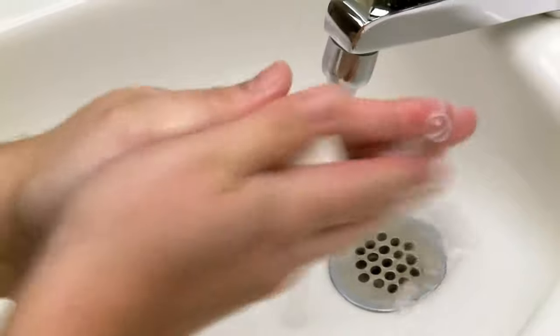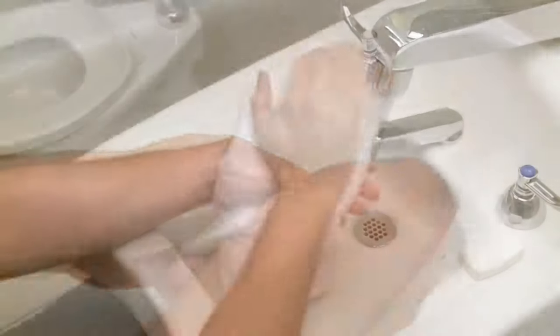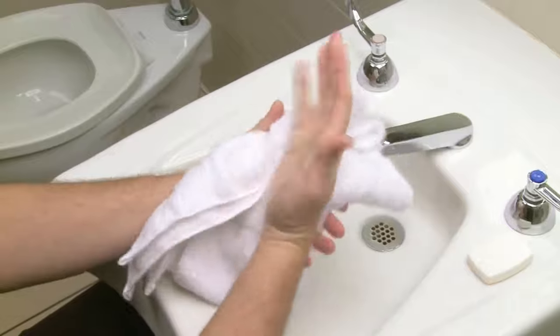Now, wash your hands thoroughly with soap and water. Dry your hands with a clean towel.